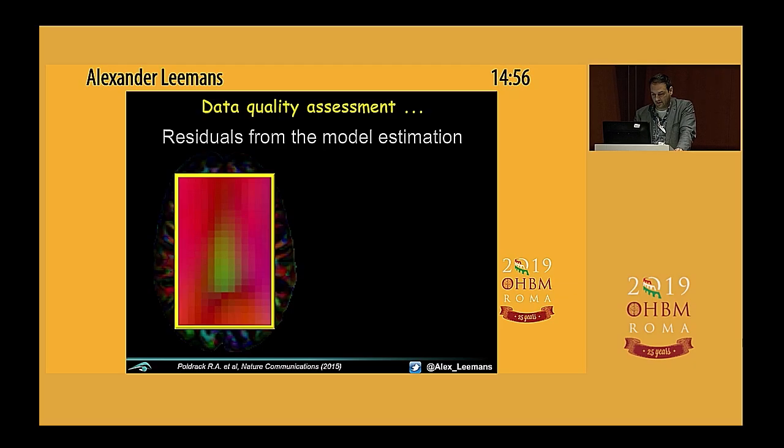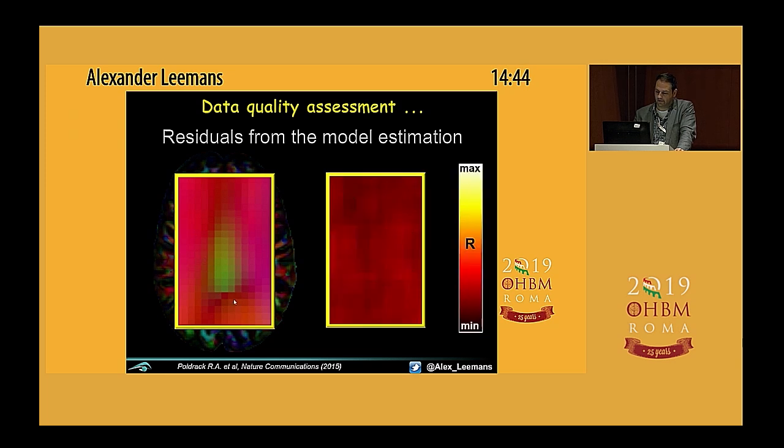And so I looked at the residual map, right? That's the first thing I do. Is it an artifact? If I were to look at this region in a residual map, I would expect to see structure in my residual map highlighting this area. But I couldn't, right? I checked which B values, and I took the B1000 regime for being within DTI limits, etc. So I was like, this is genuine, right? And so I told him, hey, are you aware that you've got a special brain?